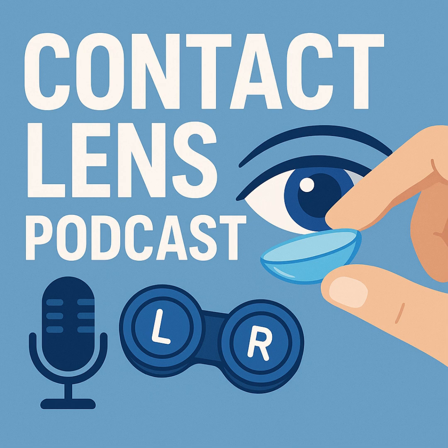Why would you want that? They create this little reservoir of fluid between the lens and the cornea. It's fantastic for people with really severe dry eye or conditions where the cornea shape is very irregular, maybe after surgery or due to something like keratoconus. Standard lenses just might not work or stay hydrated. They're more specialized, but truly life-changing for the right person.